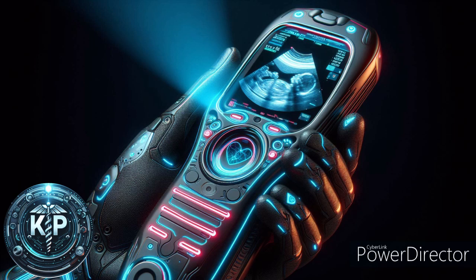When these waves hit different tissues, they are reflected back at different rates, creating echoes that are then captured by the probe and transformed into electrical signals. The CPU interprets these signals to produce an image that is displayed on the monitor. This technology is widely used in various medical fields, including obstetrics, cardiology, and radiology, due to its non-invasive nature and ability to provide real-time images without the use of ionizing radiation.